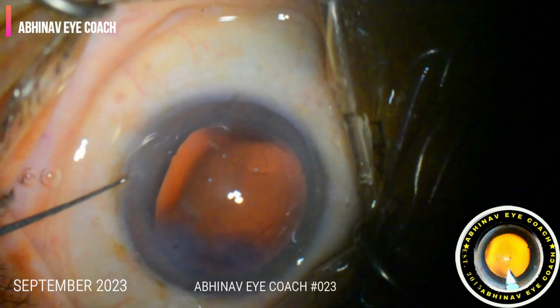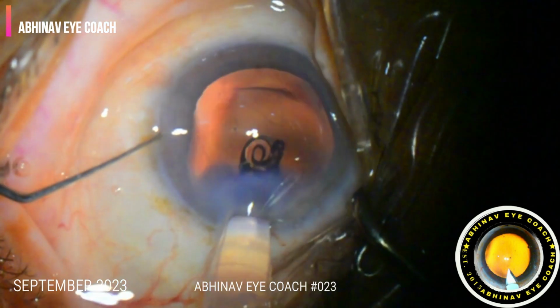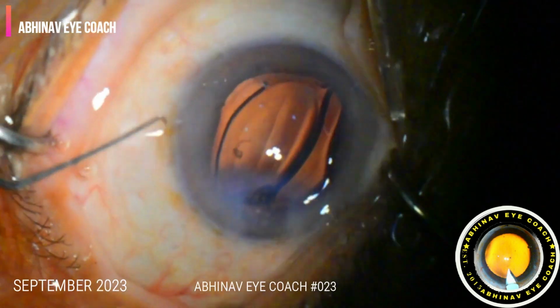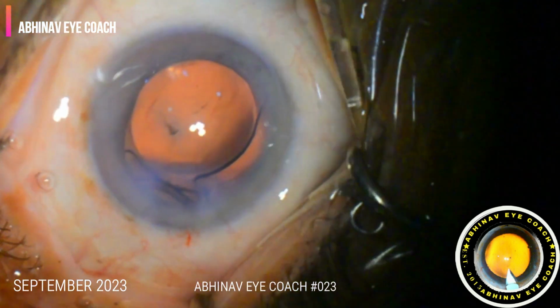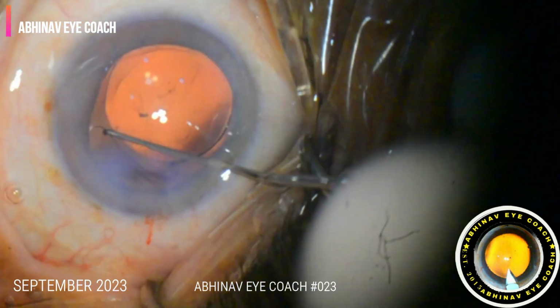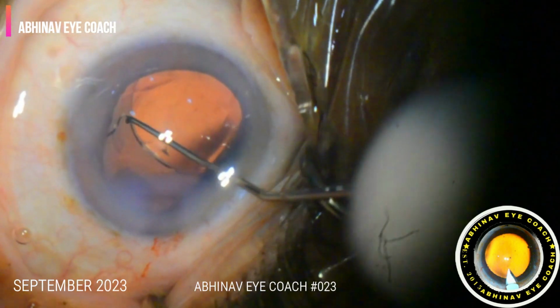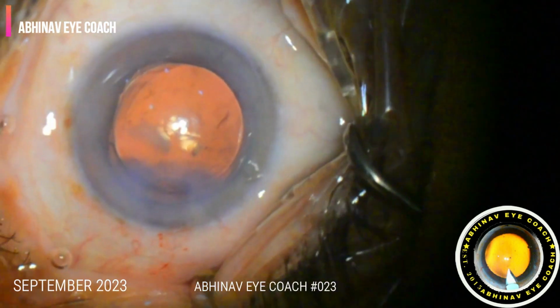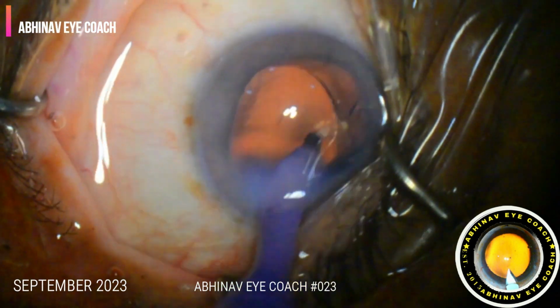And the IOL is injected into the bag. The haptics are a little bit big and closed loop. So the first haptic is directly landed into the bag and the trailing haptic is dialed inside the bag with the help of the dialer. And the complete IOL now is in the bag.